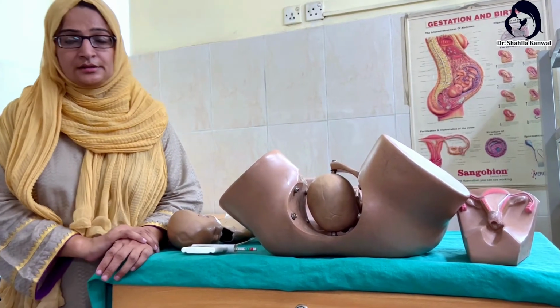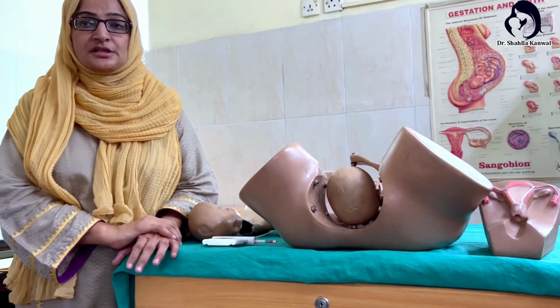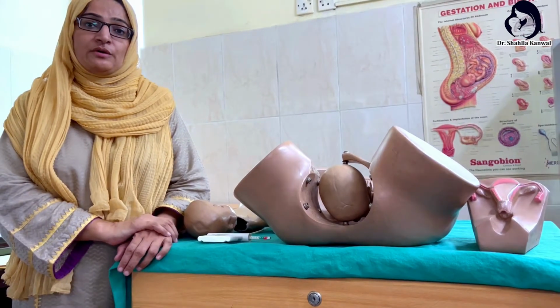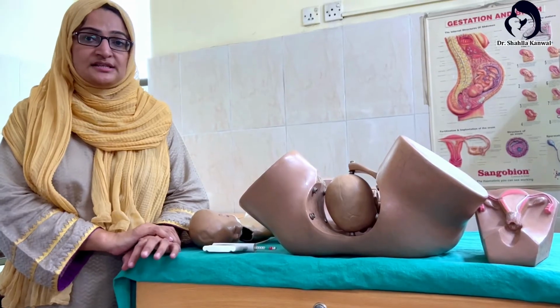For this operative vaginal delivery, you have to put the patient in lithotomy and you have to clean the vulva with the antiseptic solution. After cleaning, now the patient is ready.